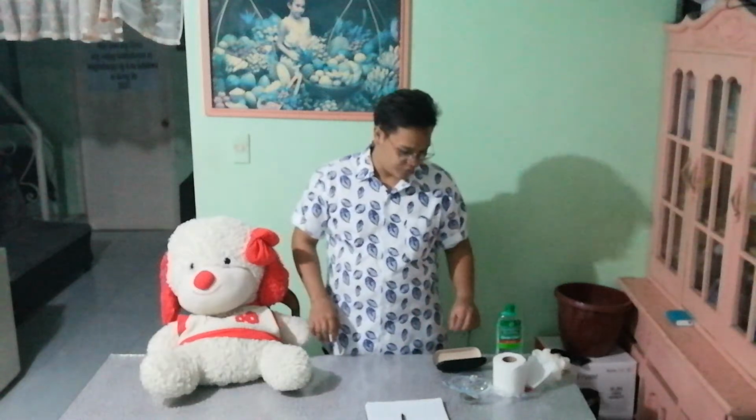So we have already moved the patient's clothes. We will now proceed to our step 3, which is we need to remove the probe from the recording unit of the electronic thermometer, and we will now again put the cover on the probe.